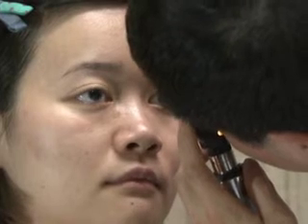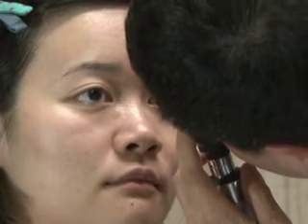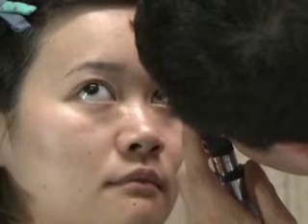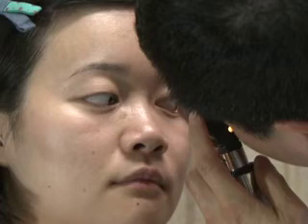Next, examine each quadrant of the retina, tracing vessels away from and back toward the optic disc. You may ask the patient to look in different directions to facilitate visualization of the corresponding part of the retina. For example, if you wish to view the upper right quadrant, ask the patient to look to the upper right.